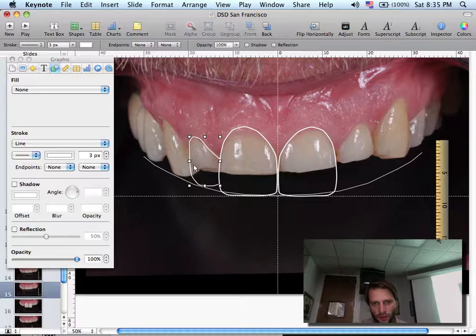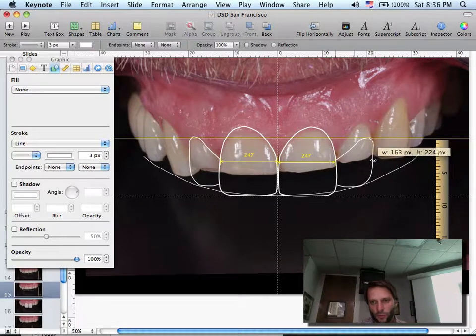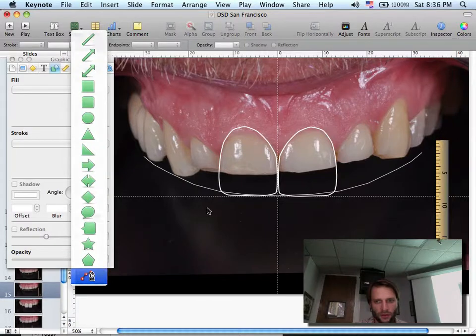Not much. I can duplicate and flip, and the yellow lines will guide me through the process to position to the other side. Now we can see already the limitation here and here. So I need to make it wider. Or when I see this discrepancy, what else can I do? I can do the opposite. Said, okay, it doesn't work, so this is a better reference.